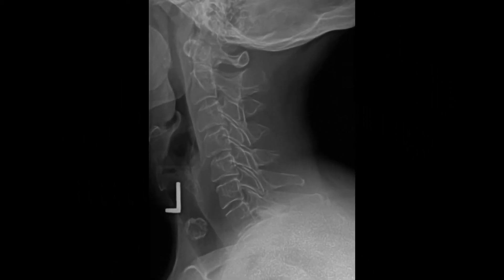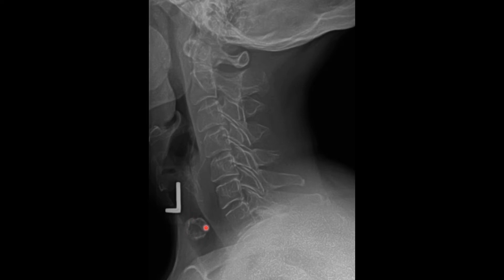Now this case is not normal. You can see anterior to the cervical spine: the hyoid bone, thyroid cartilage calcification, an improperly placed anatomical marker, and then inferior to that is a coin-based calcific density. That is an abnormality, indicative of most likely a thyroid cyst of indeterminate etiology.